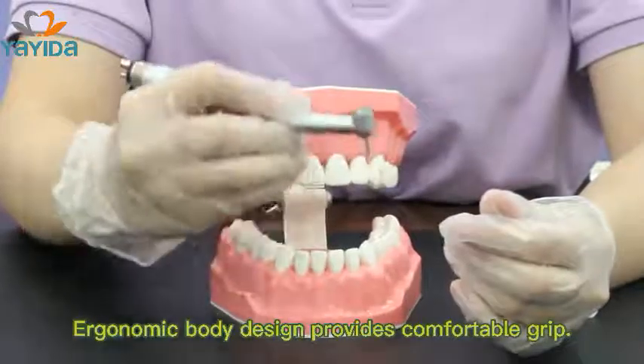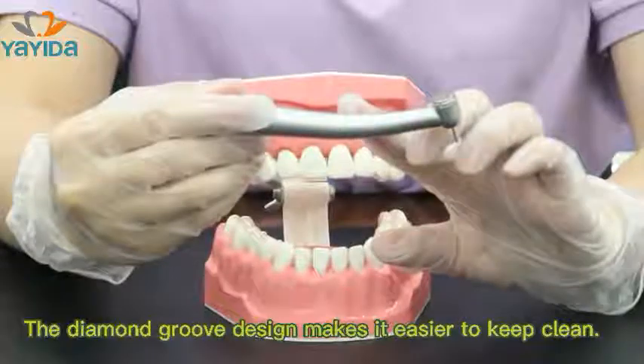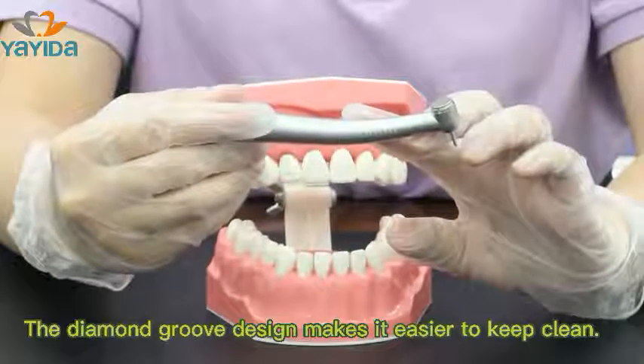The ergonomic body design provides a comfortable grip. The in-hand surface is anti-corrosion. The diamond groove design makes it easier to keep clean.